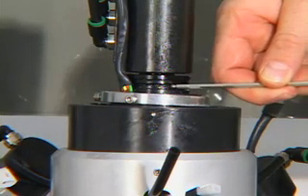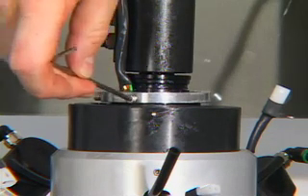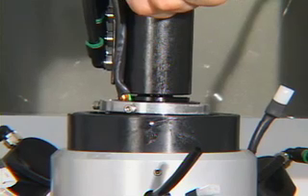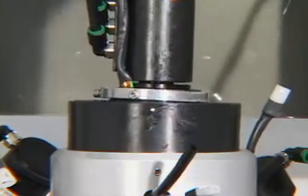Apply grease on bottom part of rotary union assembly. Push rotary union into brush block until the lock collar set bolts fit into the groove on the bottom part of the rotary union. Tighten the two Allen bolts to connect the rotary union to the brush block.